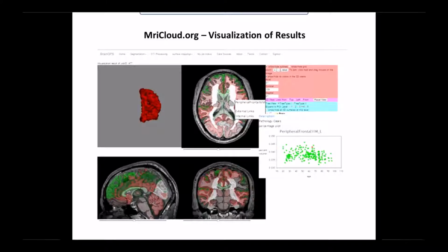Shown on the right is an output screen of when the job is ready, it's been run through, and it's available for the client to visualize results. The screen says that in the visualization client, which is a very thin client, we have 2 kinds of visualization.